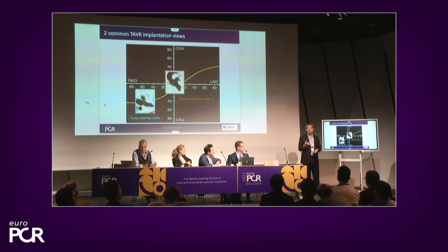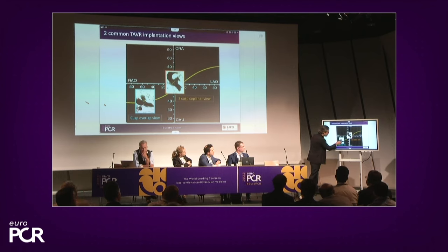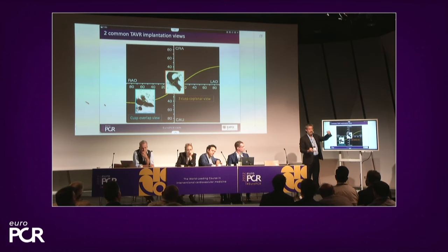So if you're going to plant a coronary stent in the proximal LAD, who's going to do it in AP caudal? No one. Who's going to go maybe cranial? Of course you will, because you're going to reduce the foreshortening and you're going to elongate the proximal LAD. So it's the same thing here that's happening. In the caudal viewpoint, you elongate, you get a three-chamber view of the heart, just like a three-chamber view on echo. So your LVOT is elongated. If you elongate the anatomy, you're going to elongate your catheter.